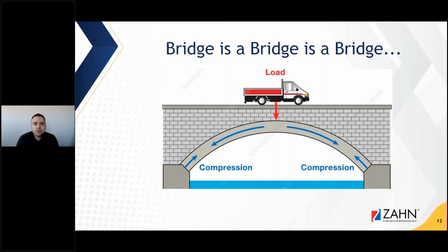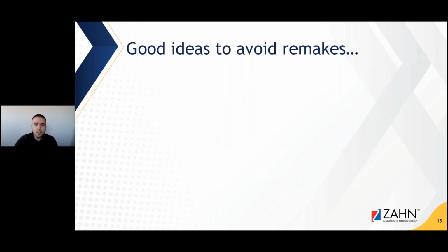So we really try to thicken, almost create a tissue design on the lingual, kind of connecting the entire lingual side, and then maybe individualize some on the labial side. And we really found that milling PMMA restorations with, let's call it, excessive lingual connector design really helps with that durability, and we see a lot fewer fractures that way.